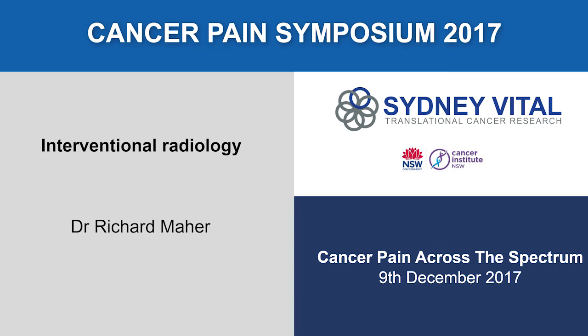So this is an MRI showing, this is a fat saturated, so it doesn't project as well here, but this is a STIR image or a T2 fat sat looking for edema. This is a vertebral body fracture, lower thoracic spine. You can see there's loss of vertebral body height and there's high signal edema. You compare it to this fracture here, which doesn't have much high signal, so that's an old and long-standing one. So we want to see fractures with edema in it. We also look for any involvement of the epidural space, and there's no involvement of the epidural space or paraspinal region in this. So this is how it's done.